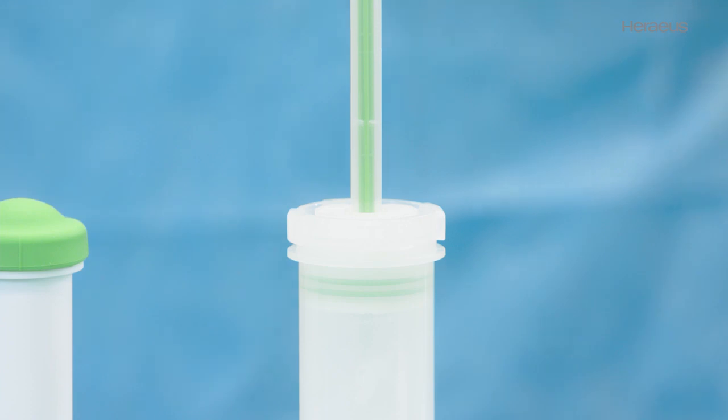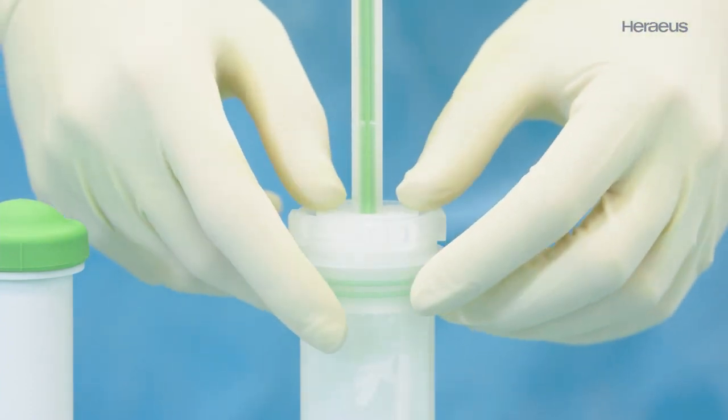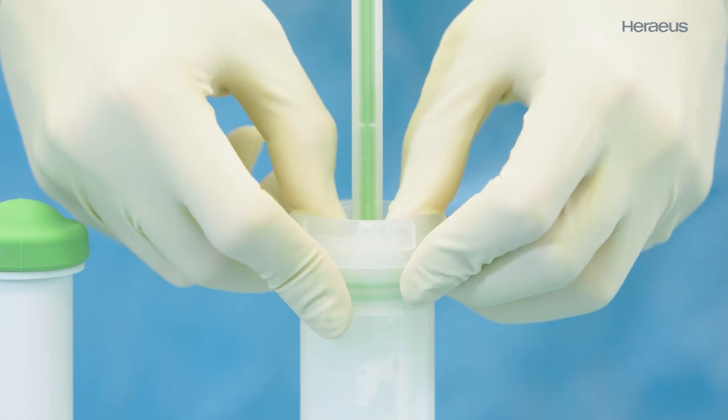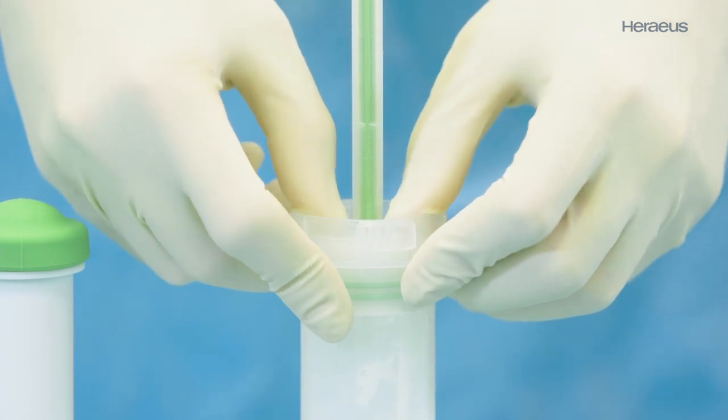Then push the sealing ring down into the cartridge and ensure that it is fully pressed so that the cartridge is closed vacuum tight. Please remember not to change the position of the mixing rod.